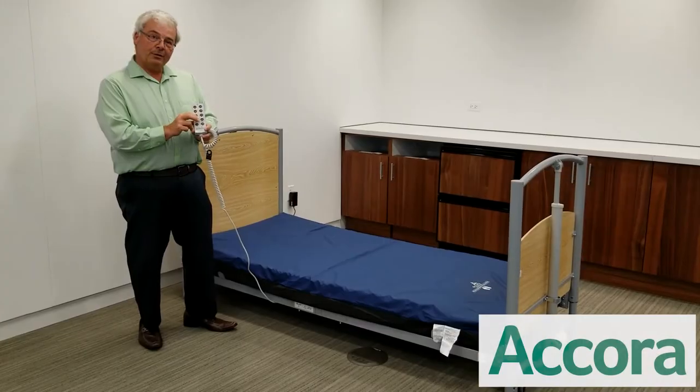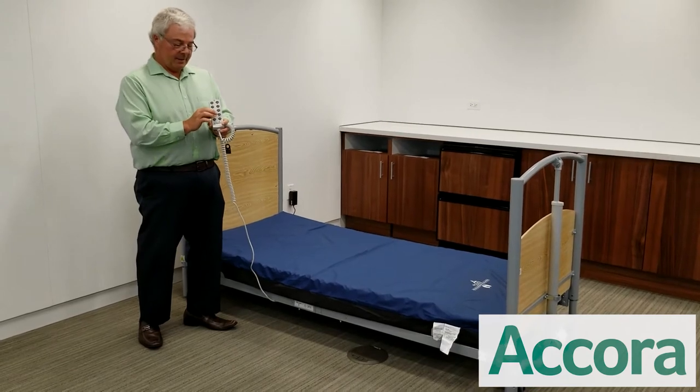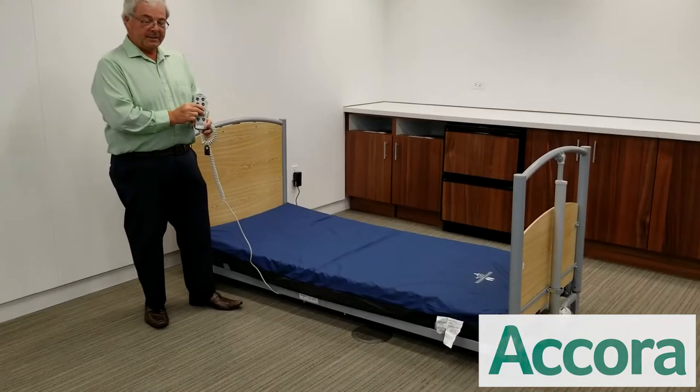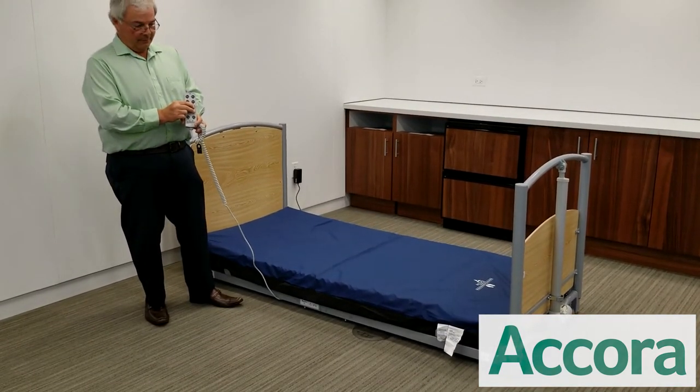To do that, you hit these two buttons simultaneously as described in the handset. When you do so, the bed will go down to its floor bed position, where the deck height will be two and three-quarter inches off the ground.